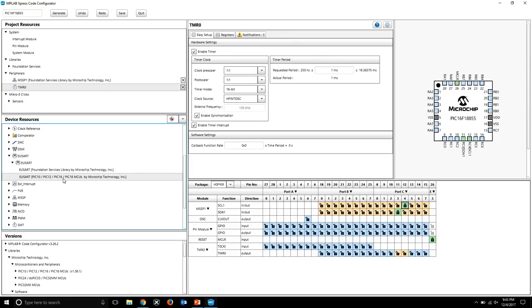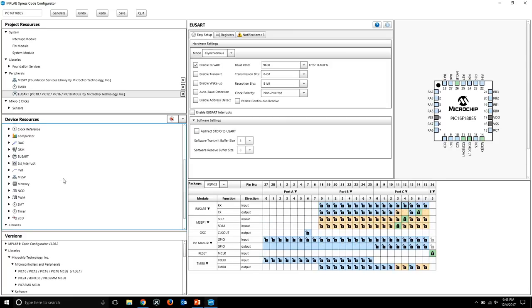So I'm just going to double click on it, and it's going to get added to the project. If you look to the right, we have enabled EUSART. Yes, it's enabled. We want to enable transmit, so I'm just going to check that box. The baud rate and all the other setup, we can pretty much leave as it is for our application. The error is 0.160%, which is perfectly fine for our application. It's not going to bother anything. But we do have choices for different baud rates and other settings here.